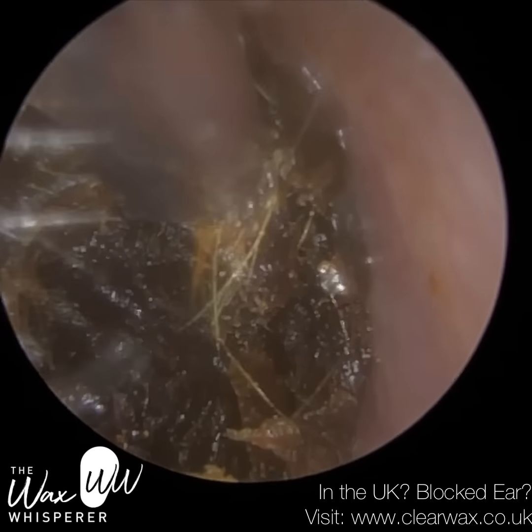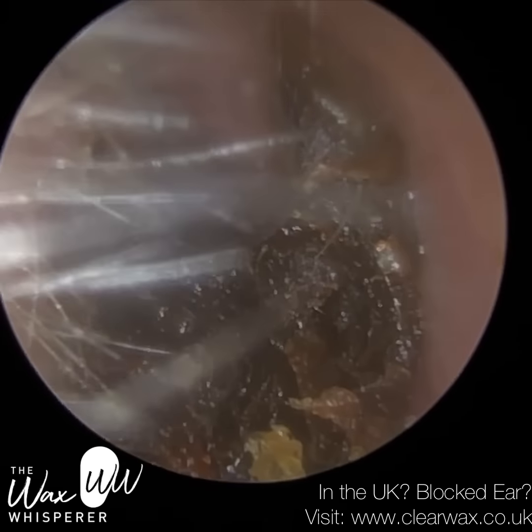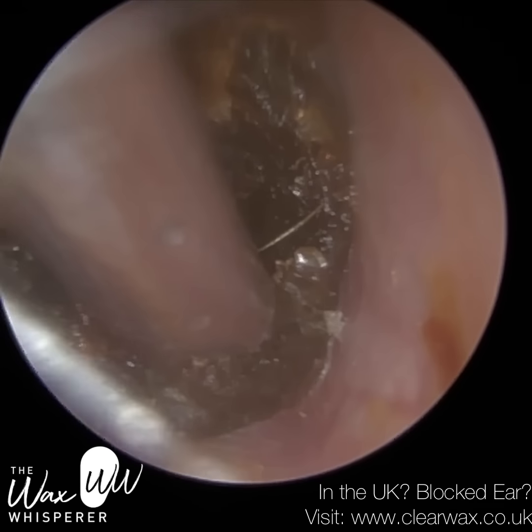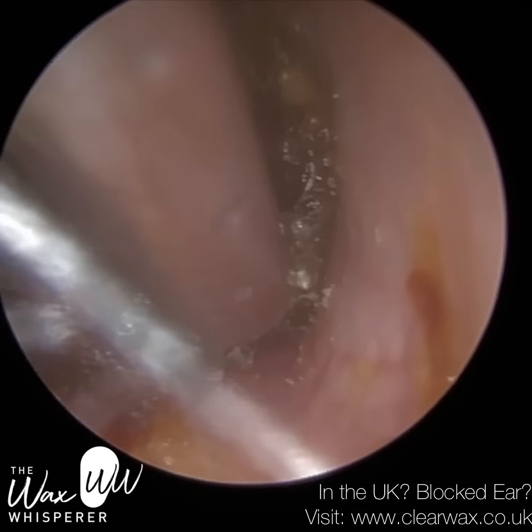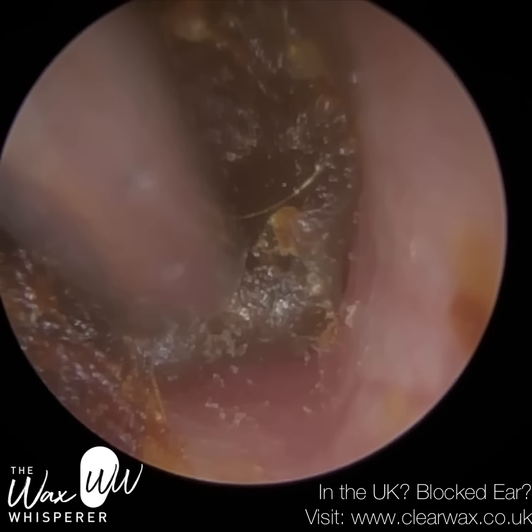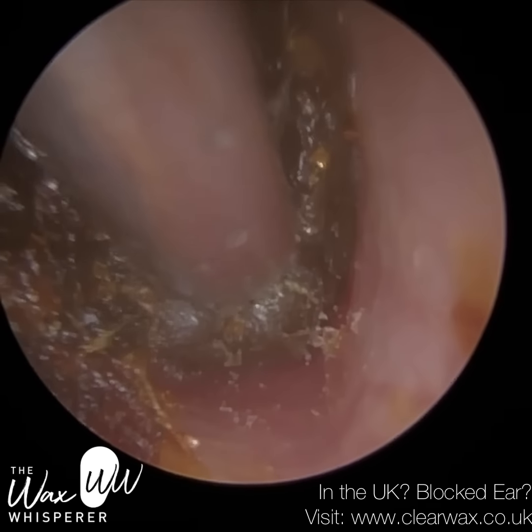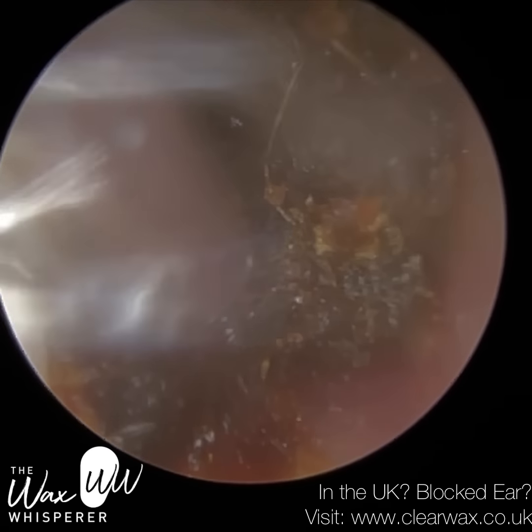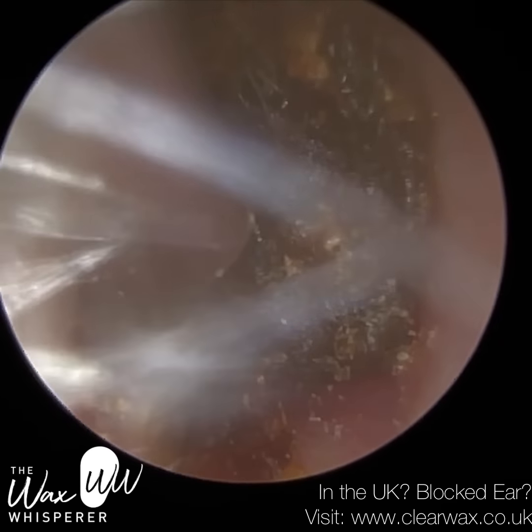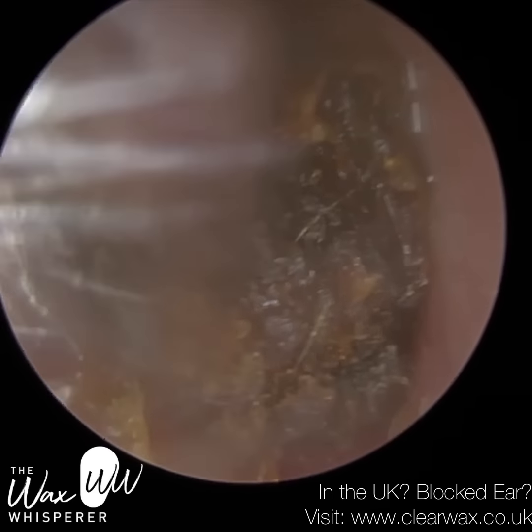So again, I'm just trying to bring this down away from the canal wall to the middle of the ear. I'm just trying to loosen it from the bottom of the ear canal. And this region of the ear canal is quite red. So again, this wax plug is beginning to compress against the ear canal wall. It's not widened it, but you can see it's in the process of doing so.